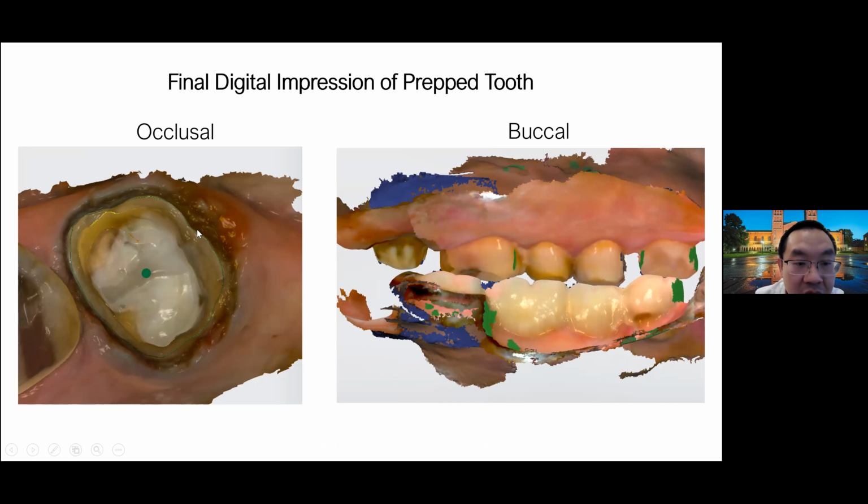That's the margin I marked for the lab. So I can send it to the lab and show them, this is the margin I want, because the lab had a lot of questions, and some of the margins were a little bit iffy too. Okay, so then you're able to do this.